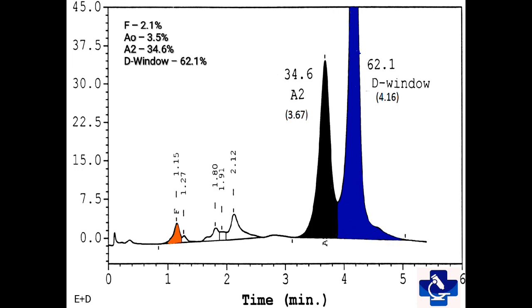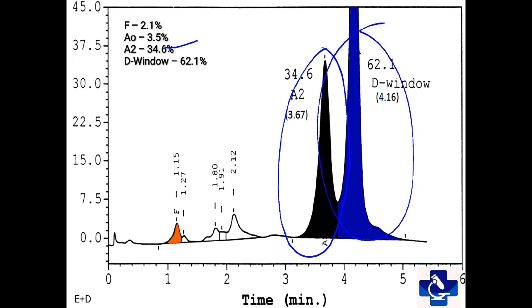In this graph, we can see that A2 is distinctly raised at around 34.6%. In the D window, we have around 62.1% and HbF is mildly raised. So this is the case of HbE and HbD double heterozygous.